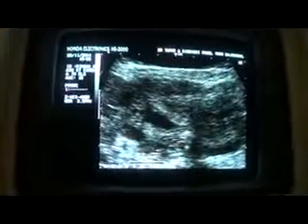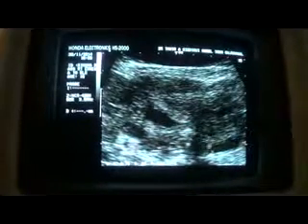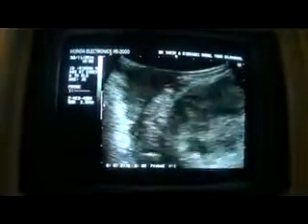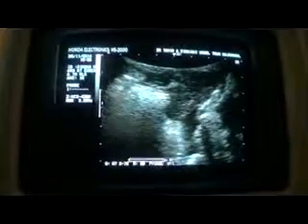This is the fluid in the pelvic cavity. This is all fluid, this is fluid, this is fluid, and when I move the probe further upwards in the region of the right hypochondrium, I see fluid in this region as well.